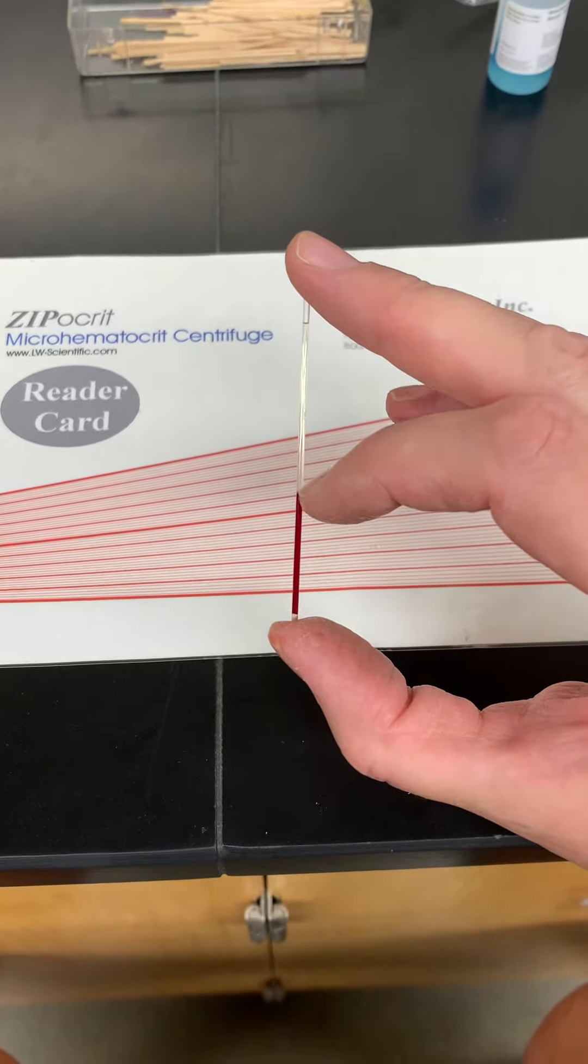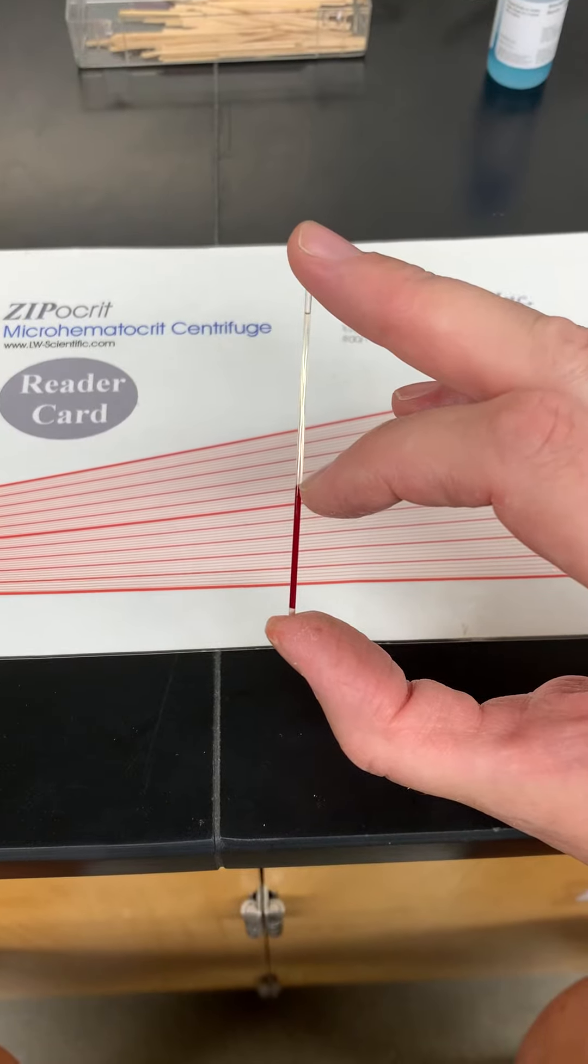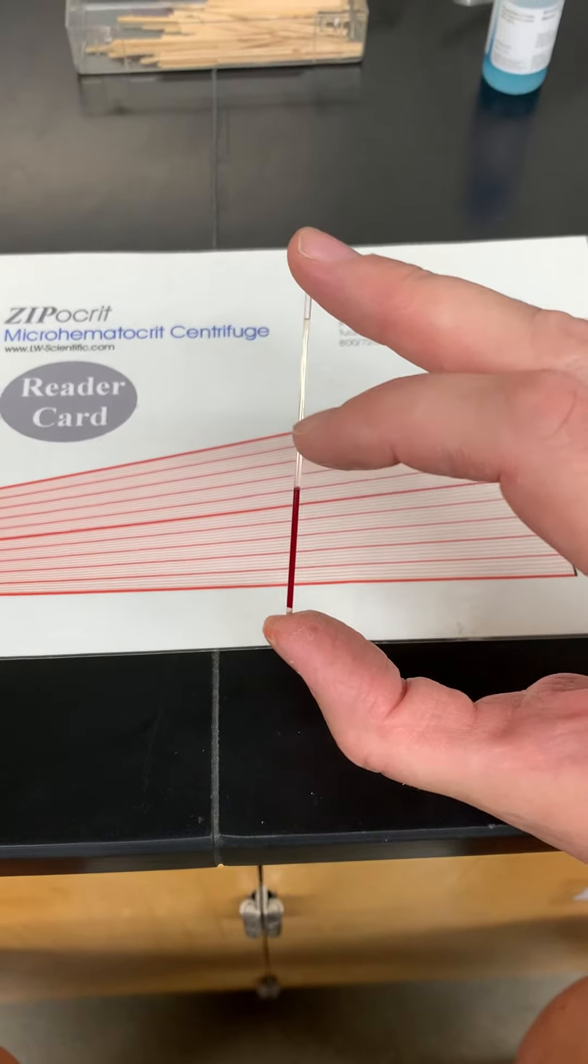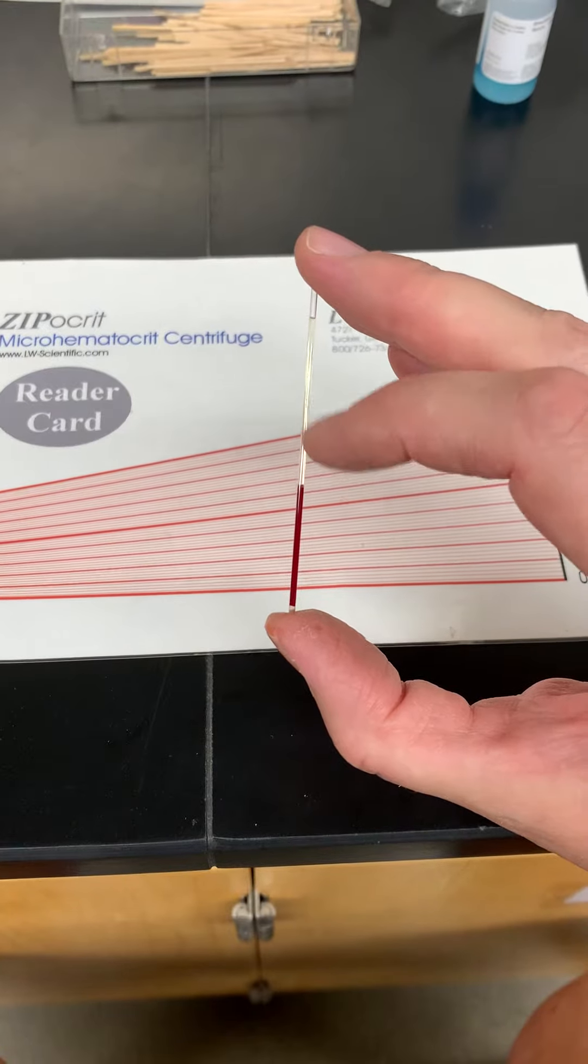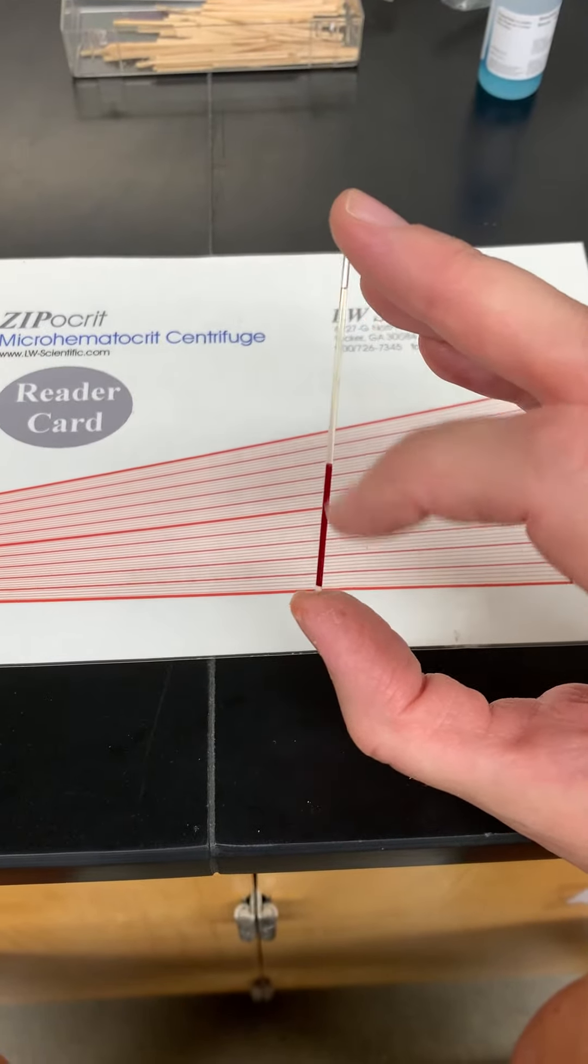The buffy coat, which is the white blood cells and the platelets, are right about here where my index finger is, and then the top of the plasma is right about here. So this is plasma, buffy coat, and then red blood cells.